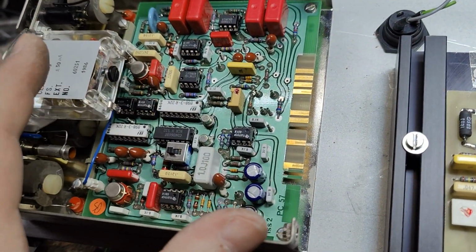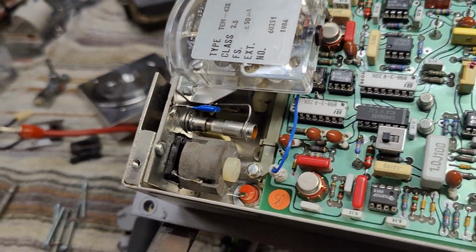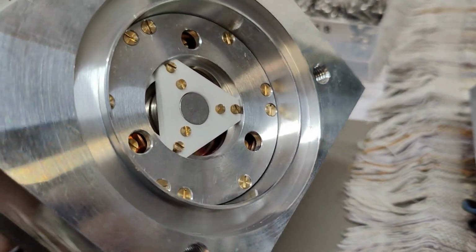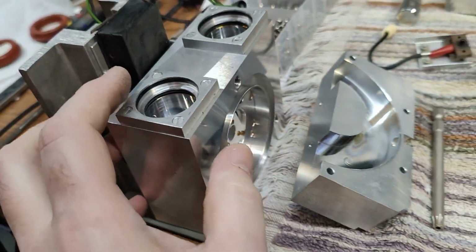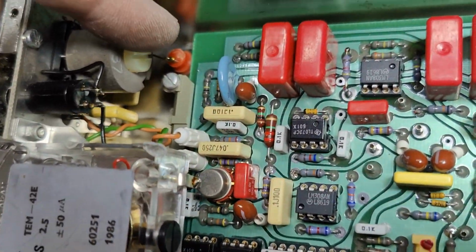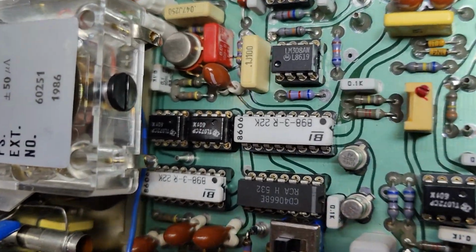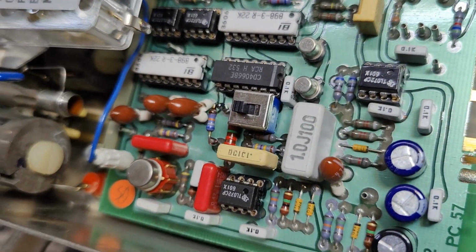But here is some of the detection circuits that's going on here. And remember the detector, we had these contacts. There's like a tiny little contact here. It goes down to this fancy secret metal alloy, something going on in here. And of course, we're gonna take that apart later. These 2 connections, they're here in the red and that one in the red. See, there's an inductor, and we got a trimmer capacitor somewhere. I can't find it really here. And there's a little switch. Here is a trimmer capacitor, that one.